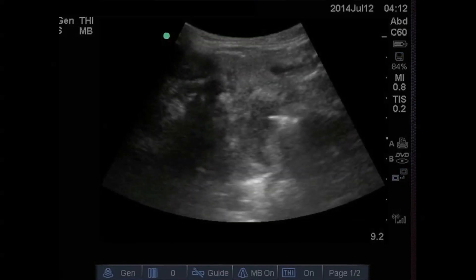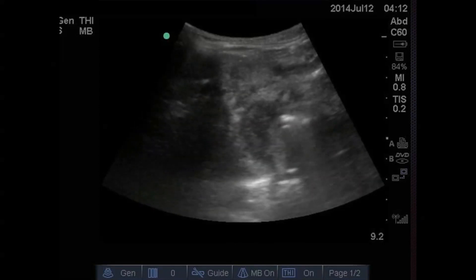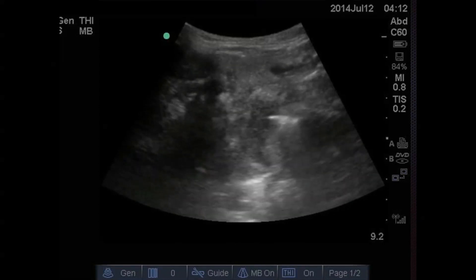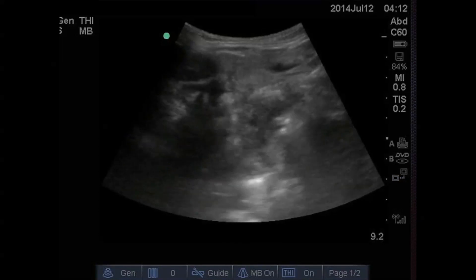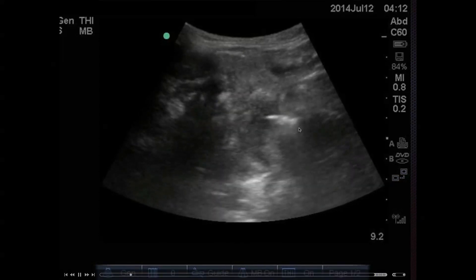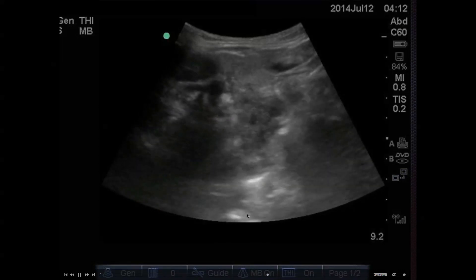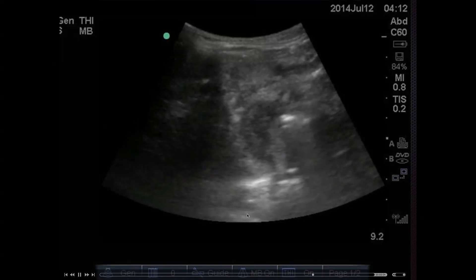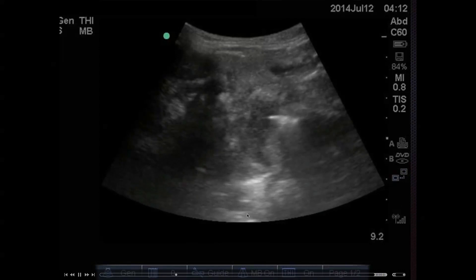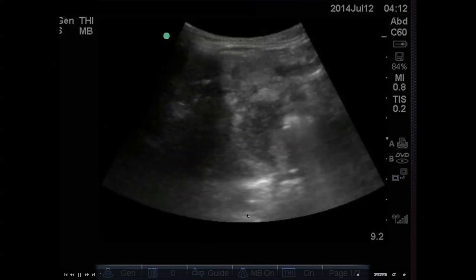This is great because you can actually see the needle in real time, like you would normally do with any kind of ultrasound guided procedure involving a needle or any other sharp object. You can also keep your carotid artery in sight and know exactly where you are at all times. It requires a little bit of rotating your probe so that you see the needle in plane on the long axis, but it's very easy to do from a superficial point of view.